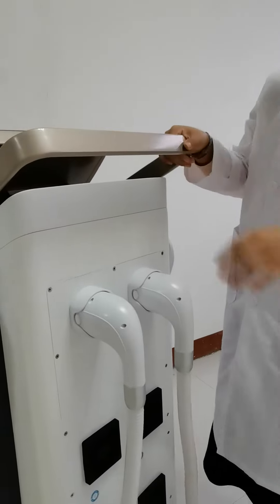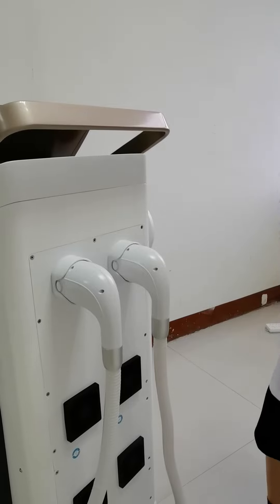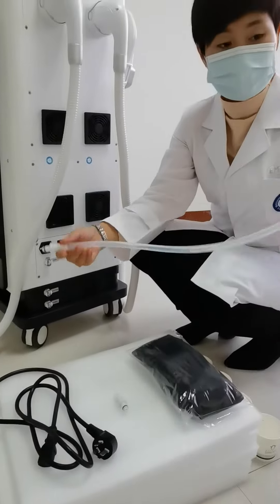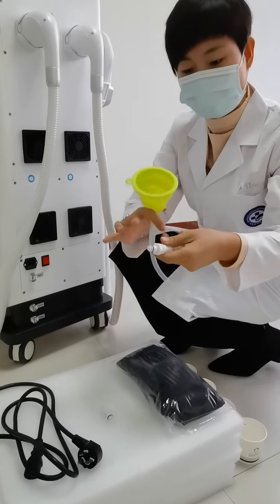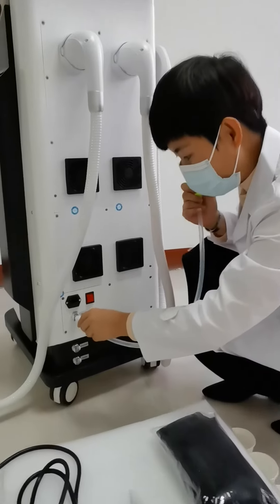Before you use the machine, you need to add some water first. Connect one connector with the water tank — put it like this, with the oil ring inside, with the inlet.